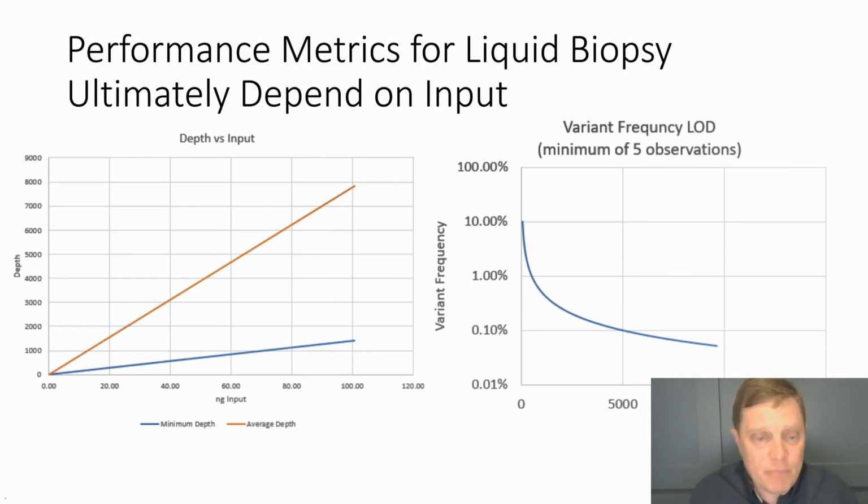And so if we pull 2 10-mil tubes from a patient, we can get 8 mils of plasma. In 8 mils of plasma, you're still going to be limited. You're still going to be lucky to get 30, 40 nanograms of cell-free material out. And that's a rare patient. In many cases, it's going to be much, much smaller in terms of the amount of material that we have.